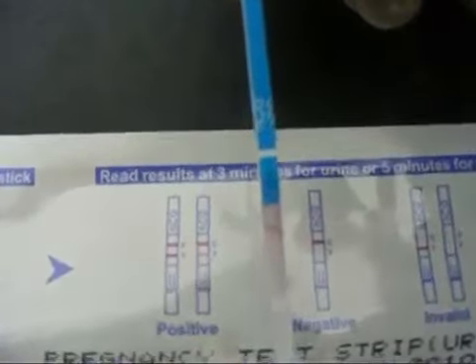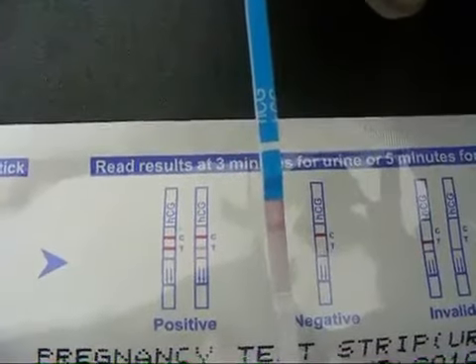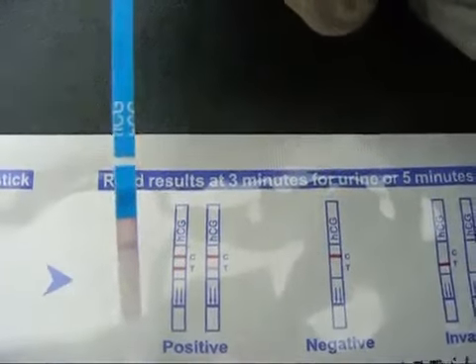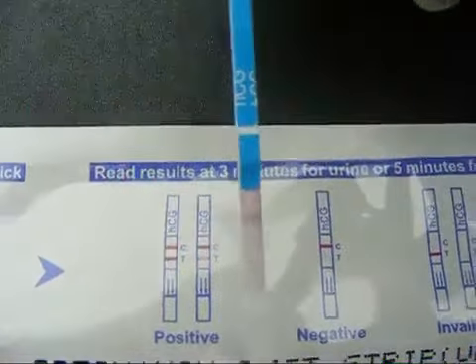Interpretation of results. For a negative result, one red line appears in the control region C, and no apparent red or pink line appears in the test region T.